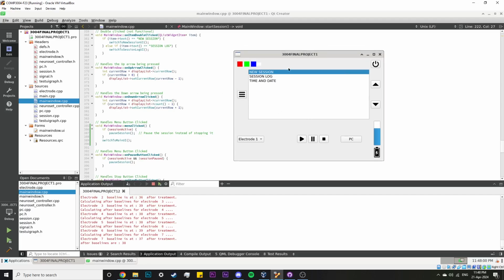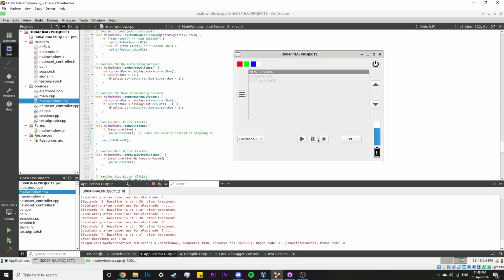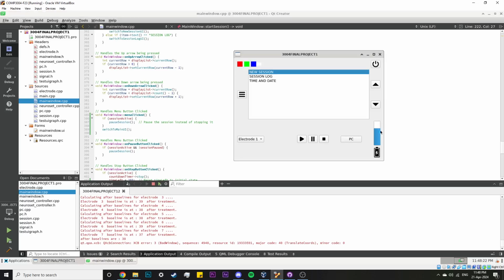The next thing that was also implemented was the power on and off button. Once the power off is clicked, the system provides you with a message stating it's powered down and it asks you to power it back up to use it. When this is hit, all the buttons are disabled. The same thing happens when the battery depletes all the way down to 0%. All the buttons get disabled.